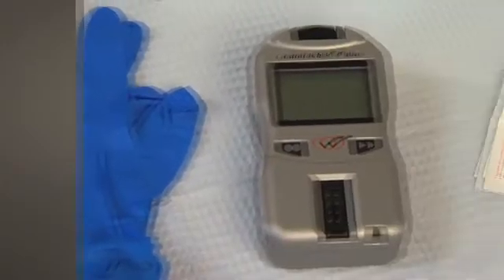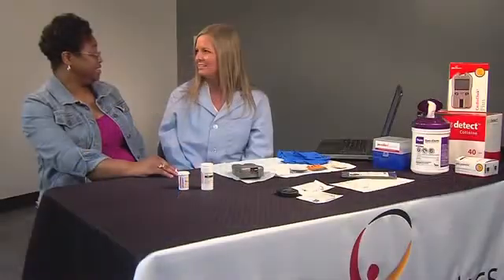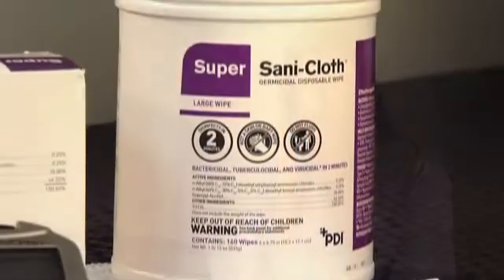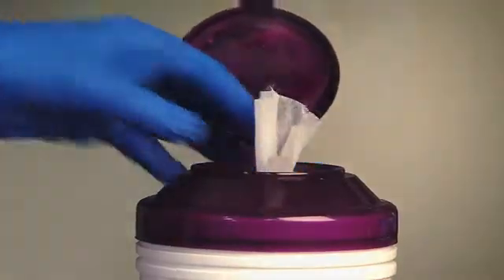Always clean and disinfect your CardioChek analyzers after each test and before you store them. We find it's easy to clean them as soon as you finish the screening and enter the results — this keeps your schedule running smoothly. We recommend using Super Sani-cloth wipes, or any disinfectant with the same EPA regulatory number.